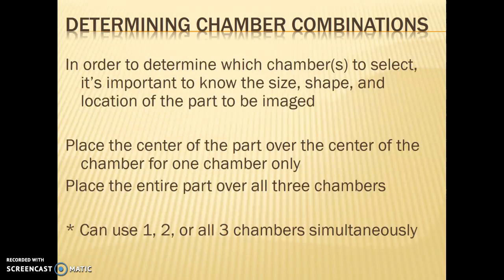In order to determine which chamber or chambers to select, it's important to know the size, shape, and location of the part to be imaged. If only using one chamber, place the center of the part over that one chamber. If using all three chambers, the entire part should be centered over all three chambers. You can use one, two, or all three chambers simultaneously.